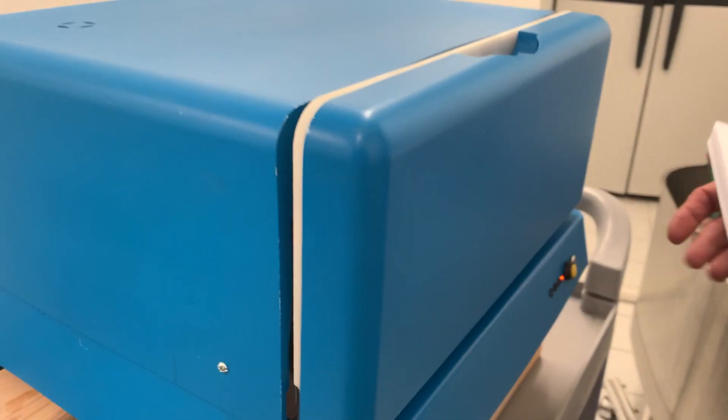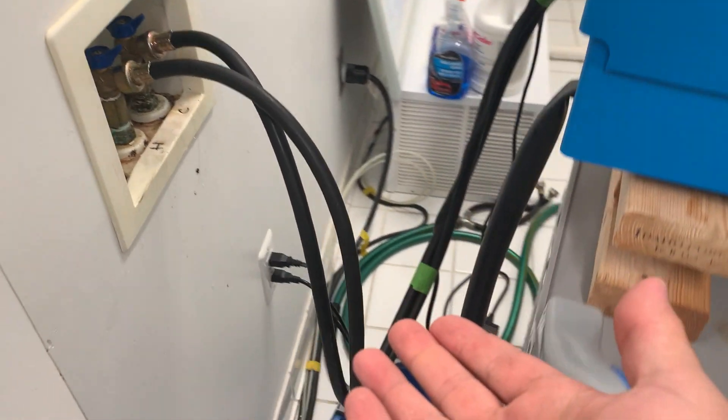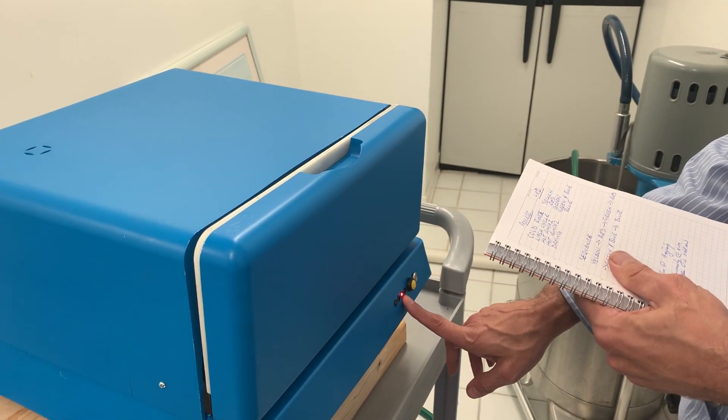The yellow light tells you you're in the cold rinse cycle. You can really hear and feel it operating — it's a closed box so it's hard to see what's going on, but you can see some drainage. Anthony, tell us more about the cycle. This particular cycle is just cold rinse, and soon we'll go to the actual wash cycle, which is red.